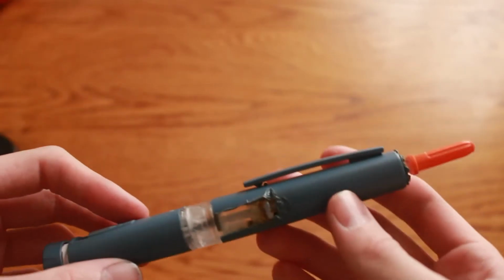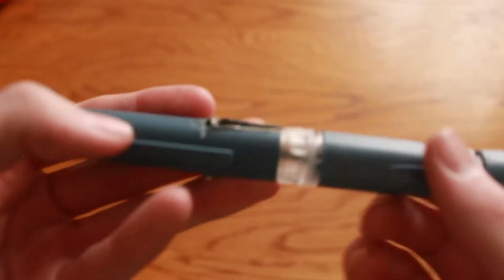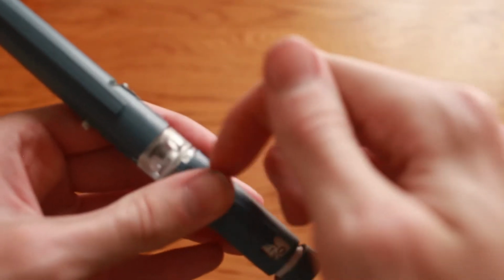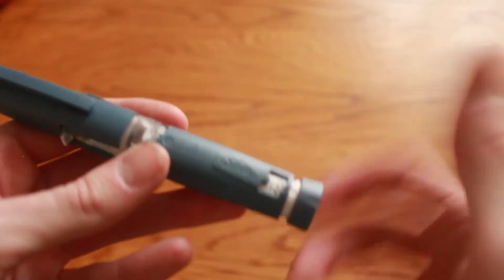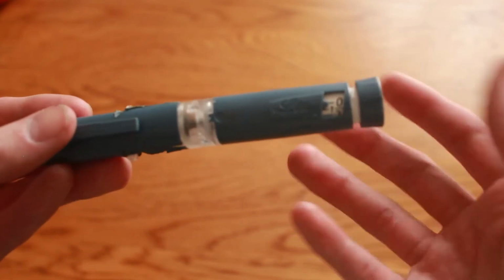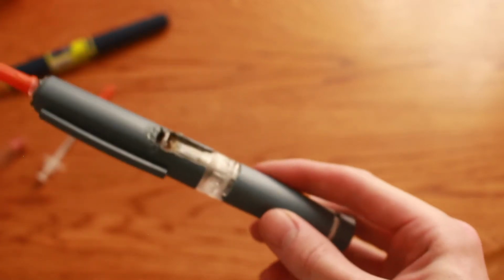One more big important reason I'm using these Lilly Kwikpens is that along with the plunger not being pushed back by anything going this way, it can actually be dialed back. If you press it down here and start turning it back like this, it brings the plunger all the way back down to zero. So you can actually reuse this. After every time you get through the syringe, you can twist this all the way back to the starting position and start over again. No other pen is like this, only the Lilly Kwikpens. That is why I'm using them. Not only that, but get this, you can actually give very interesting precise doses with it.